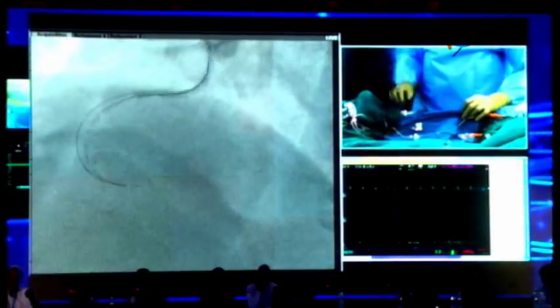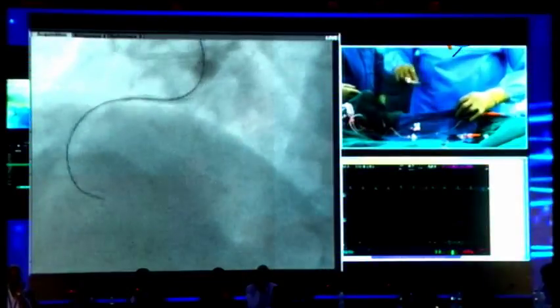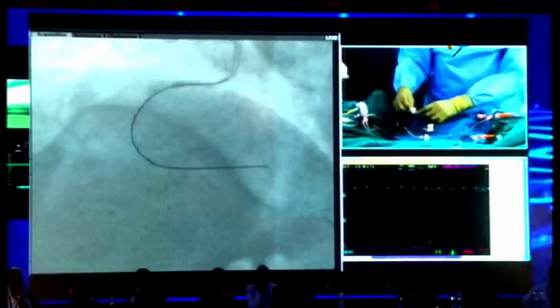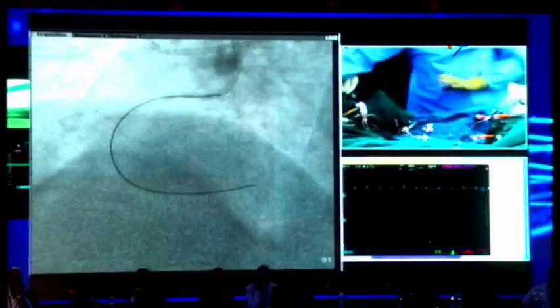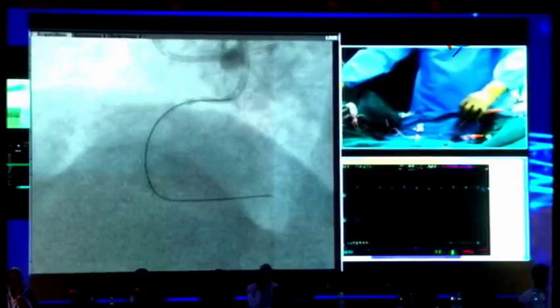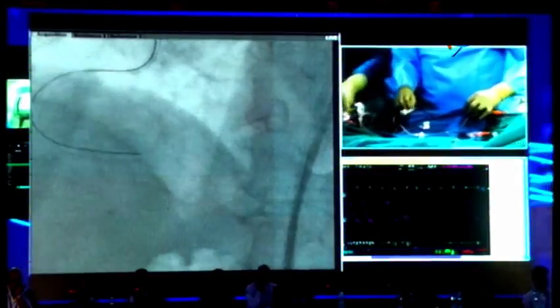Okay. This is, oh, the balloon's back. Your wire is back down. Yep, I see that. I'm in the same spot again. Okay, no, don't do anything right now. So where are you going to stick in the PD? I need it. No, before the crux. Okay.